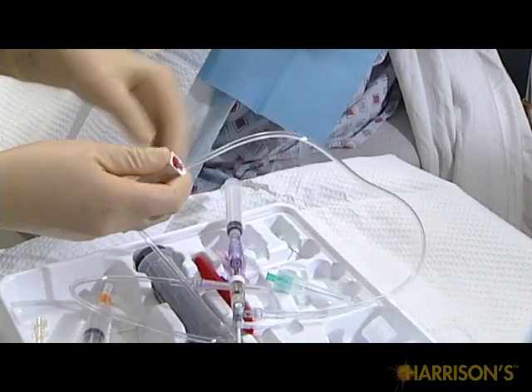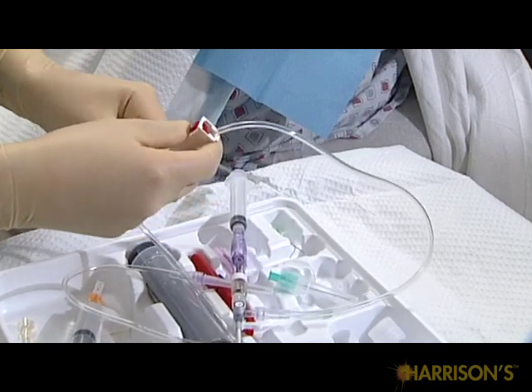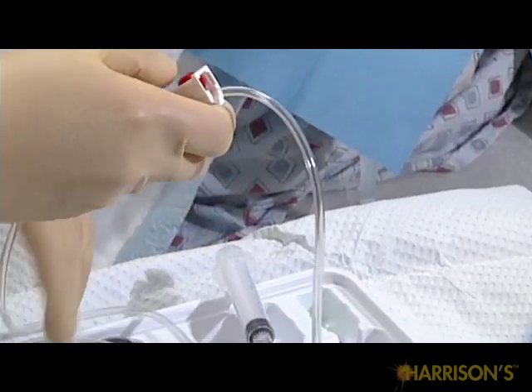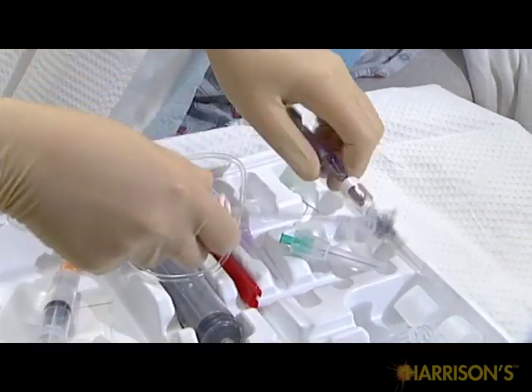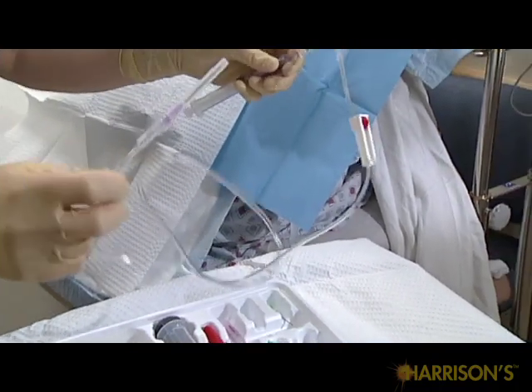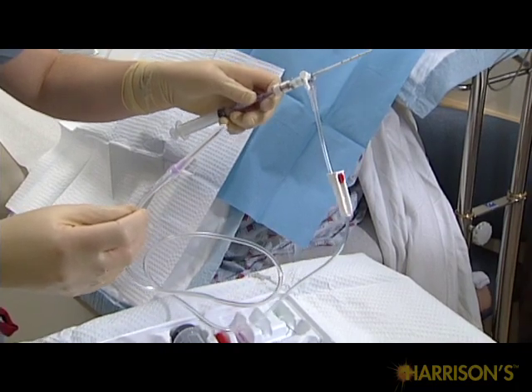Some types of pressure tubing have a roller attached through which you can control flow. If this is the case, slide the roller toward the sterile end of the tubing, away from the straight 14 gauge needle, so that you can maintain its sterility and control flow.